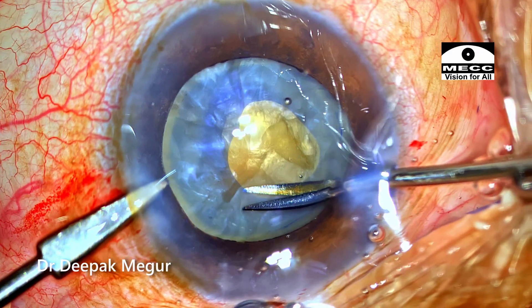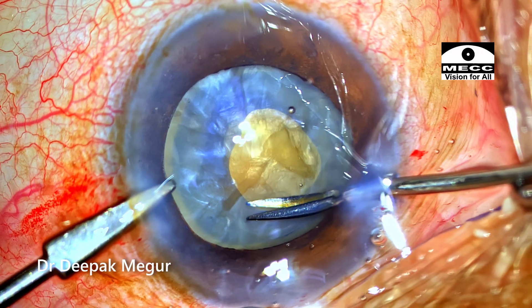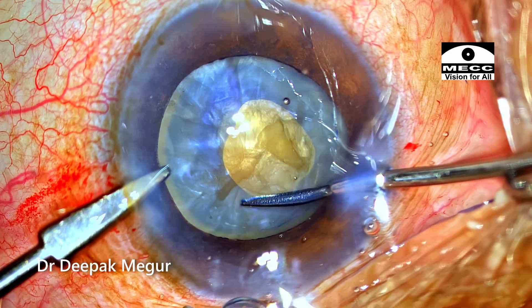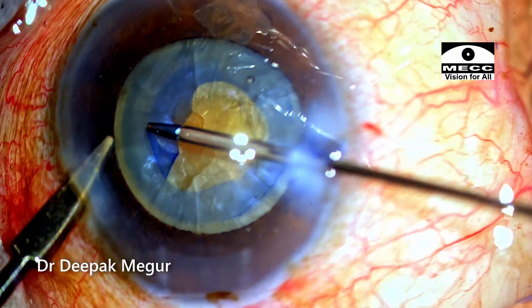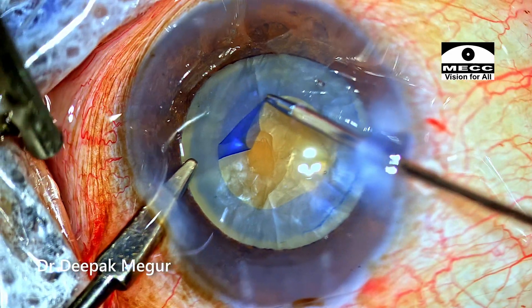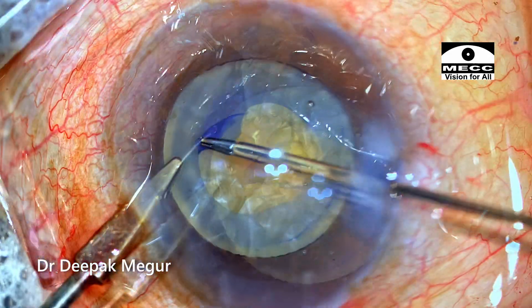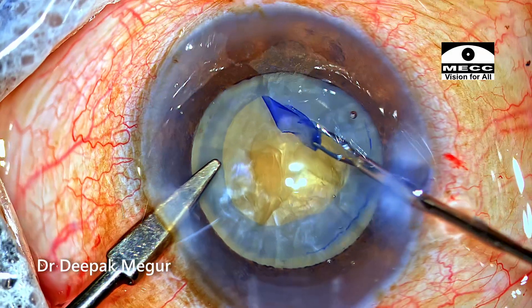I want to ensure that the cut is tangential, not radial. That is the reason the angle of attack is from the side port — this ensures the flap will not run away. The globe is stabilized with the second instrument, the flap is held with forceps, and I am now performing the secondary, larger rhexis.